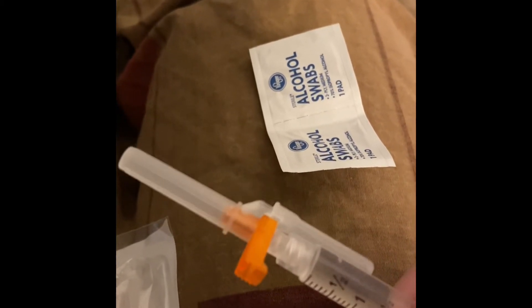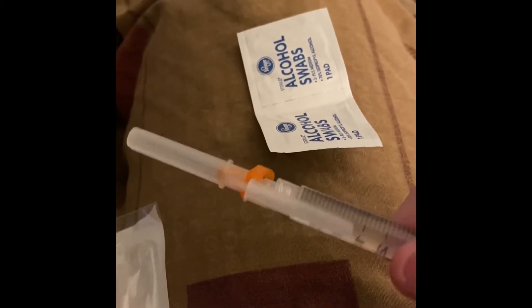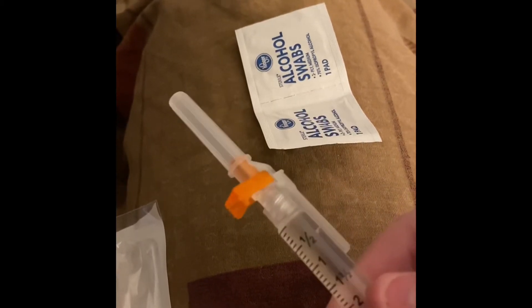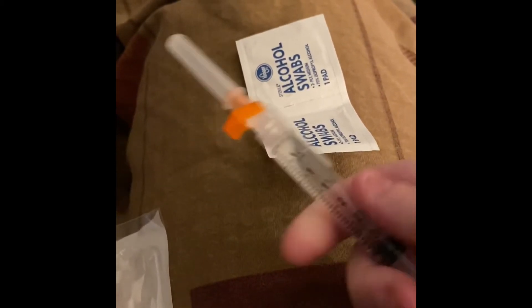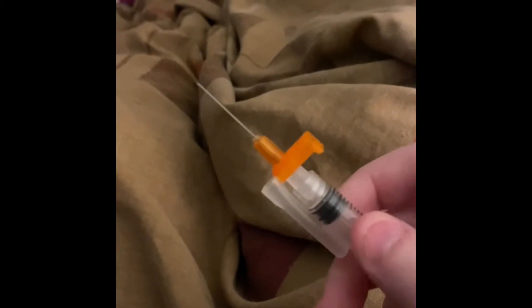I got a new needle tip this time when I got my needles refilled. It's a neat way to dispose of the needle and keep from accidentally hurting yourself. I have to give myself my shot first, but then I will come back and show how it gets rid of the needle. I'm gonna leave the needle uncapped so you can see how it works.